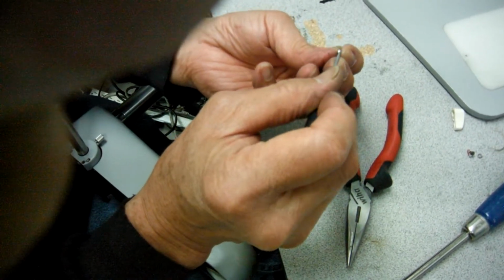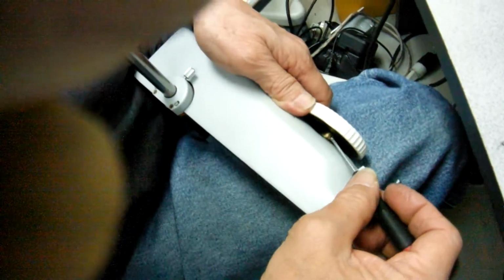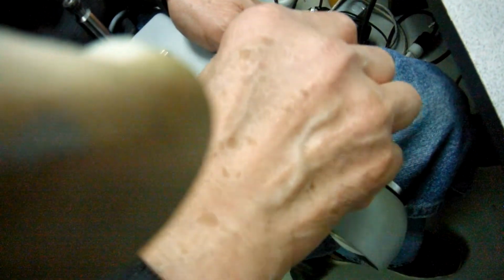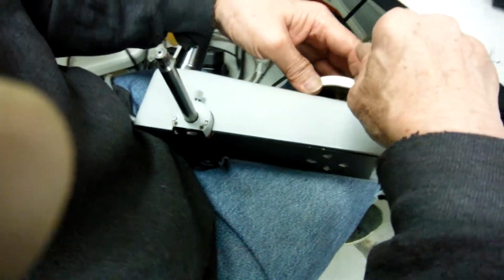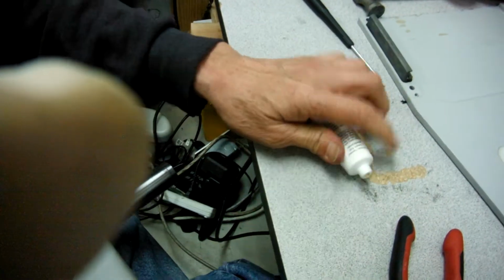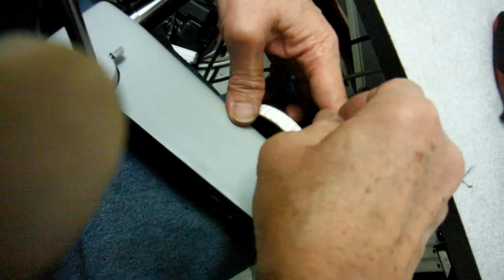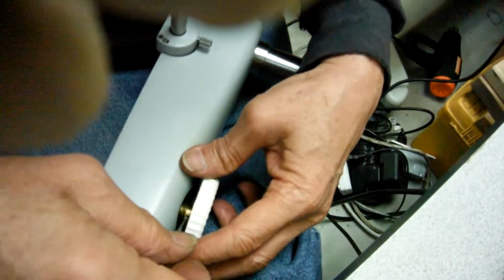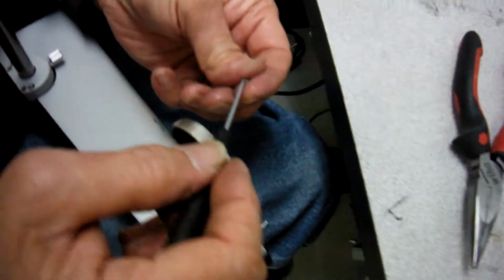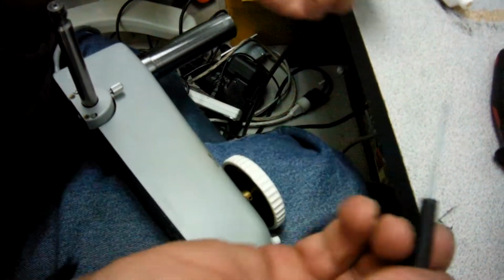Sometimes you have to use this screw to hold it in place too. Make sure you don't lose that screw inside there, because you have to take the cover off again. So when you do this, make sure you put a little bit of grease on there, and then put it on the top of that screw. I'll take it apart so I can tell you what I'm doing, because sometimes you put this screw in there, it falls inside, and then you have to take everything apart to get the screw out.